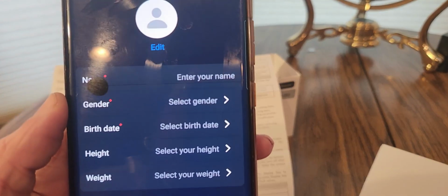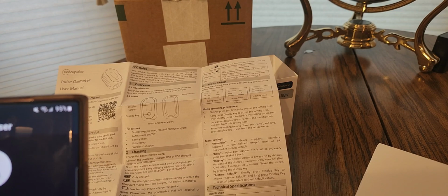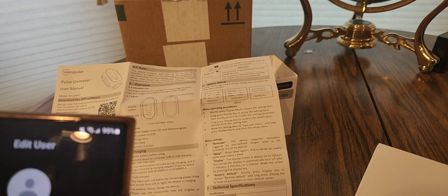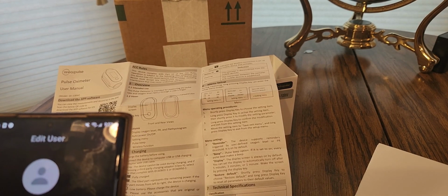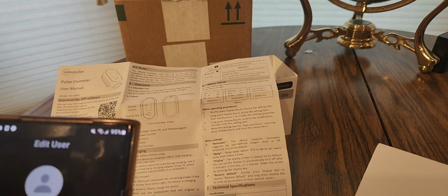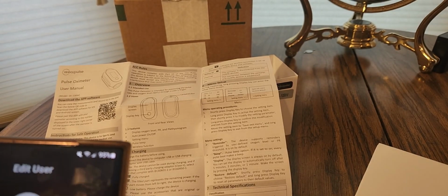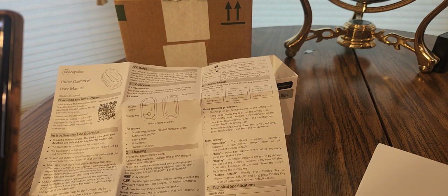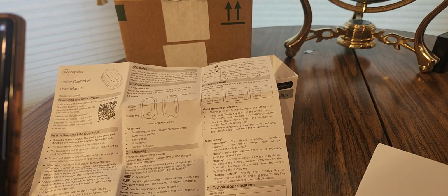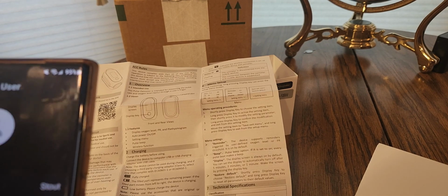Okay, once you get inside, it's going to ask you for your name. Whoops, sorry about that. Phone almost dropped. Gender, birth date. Gender, male. Birthday, oh man. 4/19, April 19th. Got that down. Height, 5'11". You can switch centimeters to feet. 6'1". And then weight. That's none of your own business.